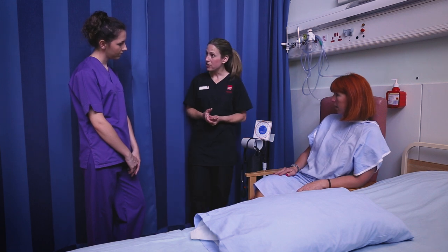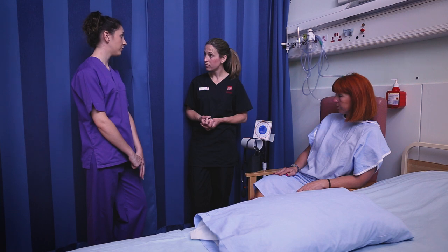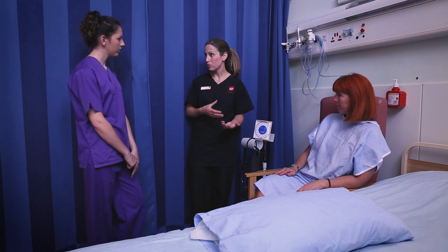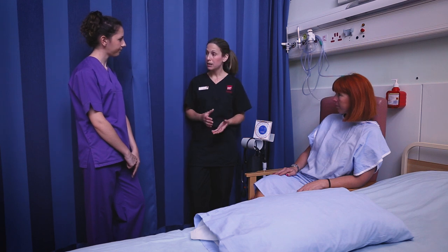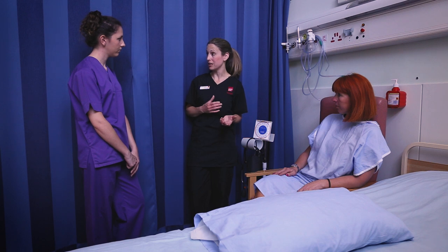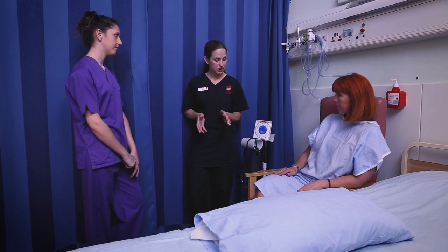Can you remember what we're measuring when we're measuring blood pressure? We're measuring the pressure of the blood through the arteries — the blood as it pumps around the body through the arteries. It's a really important measurement in clinical practice; it's a good measure of how healthy somebody is, so we do take this measurement quite a lot.